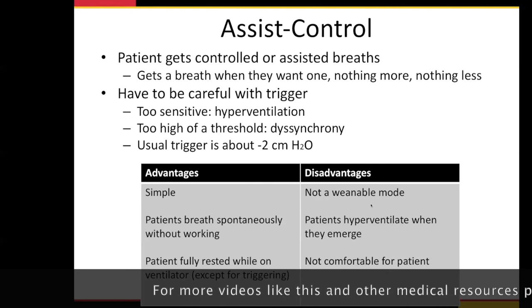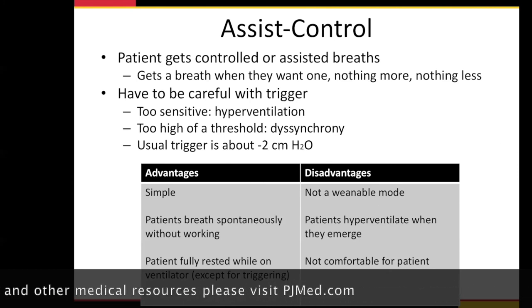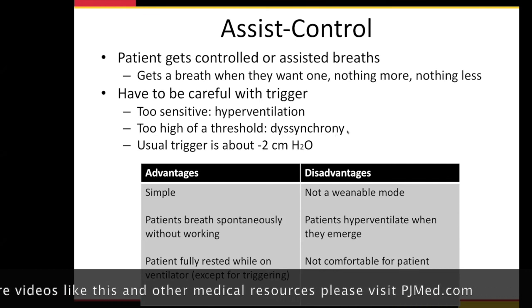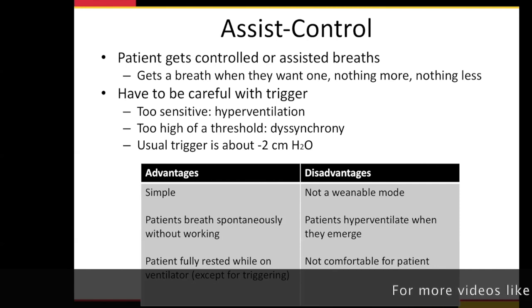The problem is it's not comfortable. If I were to take any of you and put you on this mode, you wouldn't like it because it's gonna breathe 12 times a minute and you may not wanna breathe at that 12 times a minute. You may wanna breathe in between. And when you try to breathe on top of a breath the ventilator's giving you, it could stack your breaths. So it's not a comfortable mode. And so the problem is if someone's not sedated, they can get very desynchronous on this mode because it's uncomfortable. You are basically telling the patient exactly what you want them to do with this mode. It's the most simple mode, okay? Continuous mechanical ventilation. It's not comfortable.